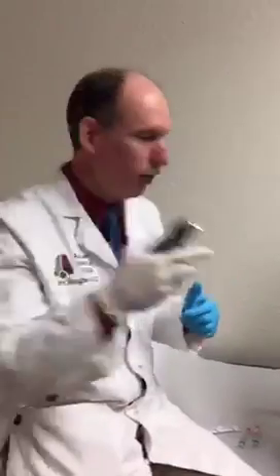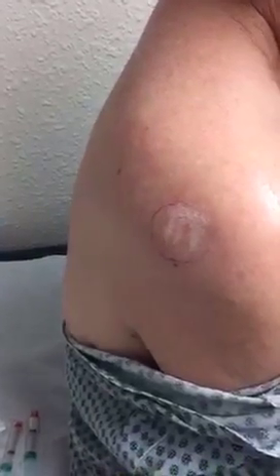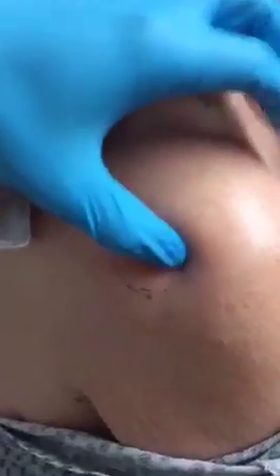All right. So I'll get over here so you can come around this side, and we're going to spray this on. And what we're going to see is the skin turn white. This is cold, by the way, but this helps it not to hurt as much. All right, it's starting to turn white. Don't want to do it too long because causing frostbite isn't good. In this case, I do agree with purpose, when we freeze skin lesions. All right, so I put my thumb there, my forefinger here. My thumb is cold.